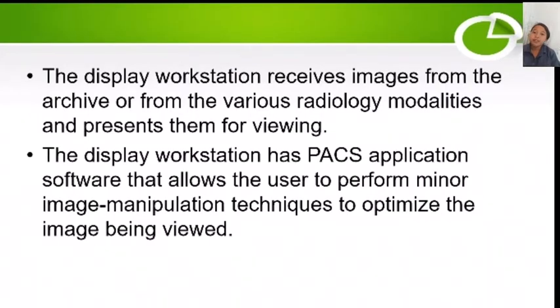The display workstation receives images from the archive or from the various radiology modalities and presents them for viewing. The display workstation has PACS application software that allows the user to perform minor image manipulation techniques to optimize the image being viewed.